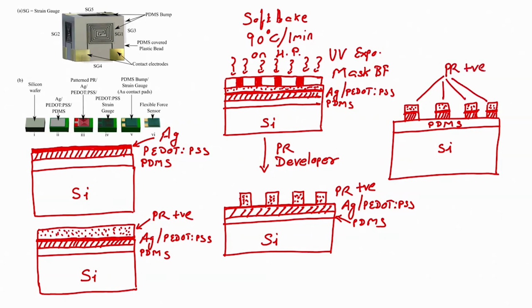Photoresist positive, right. This one would be silver on PEDOT:PSS, this would be PDMS and the base would be silicon, correct.